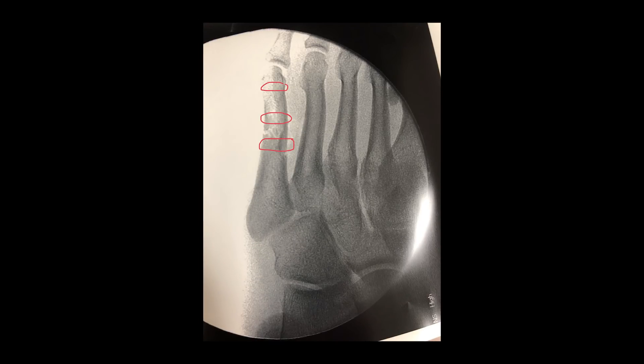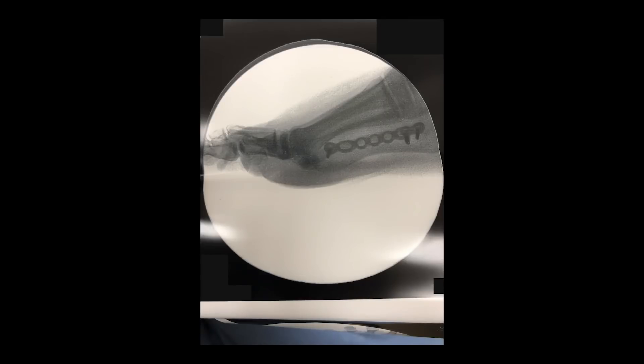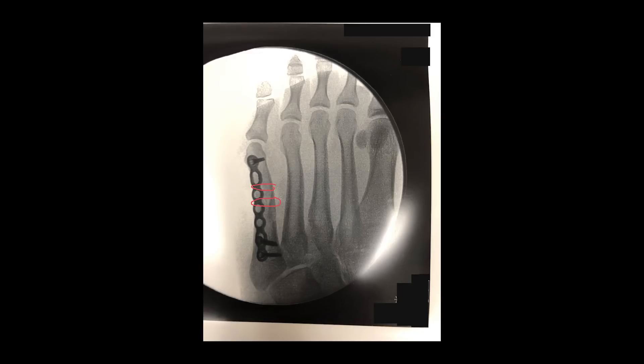In this image you can see the approximate location that I've placed the sutures. Here it is after we've placed the plate over our fracture. I always like to add a plate over these for added fixation distally and proximal to the comminuted fracture. I had just a little room for two screws proximally and one screw distally. I reinforced the plate to bone with two more suture cerclages as indicated with the red markings. The patient has been doing very well and has had great outcomes given the level of comminution she had originally.